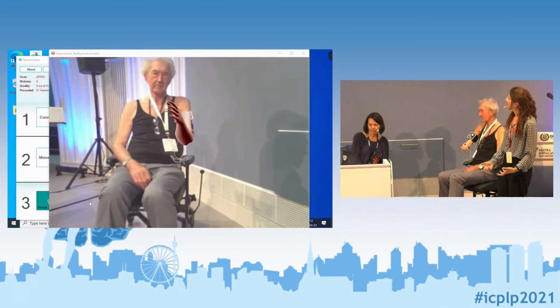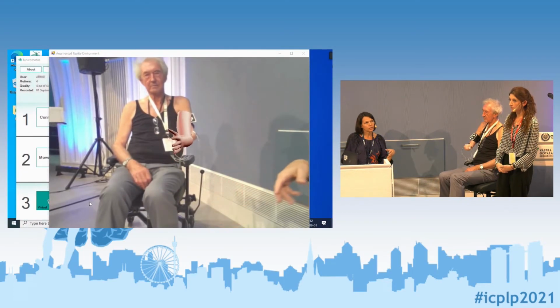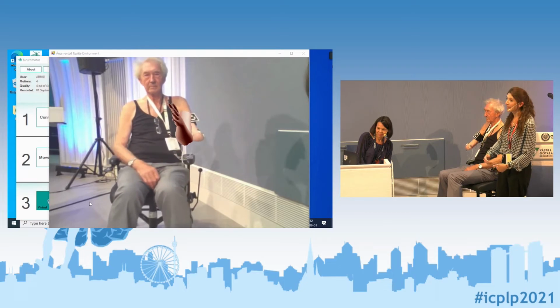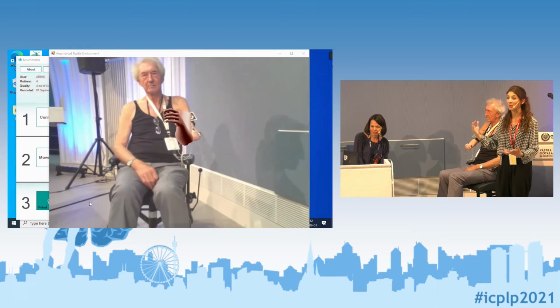And if it's hard to find the movement, you can tell the patient to use the other arm to do it simultaneously. But you don't have any problem finding it. So it's quite interesting. Some participants love this stage because it's quite fascinating.